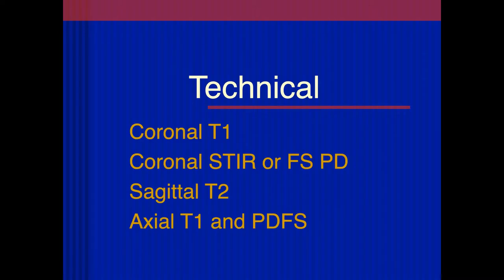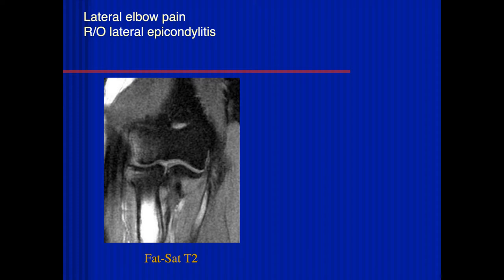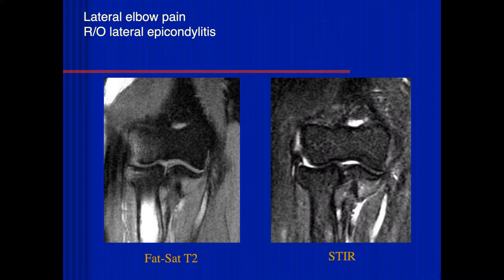We'll talk about MR of the elbow. We don't really need to go through the technical aspects of the pulse sequences. This is a patient that came with lateral pain. There's increased signal on the radial head as well as the lateral side, and I'm not sure if that's real because it does look like there's artifact in this examination. There's also some increased signal on the lateral condyle and epicondyle. I'd like to compare to a STIR image.